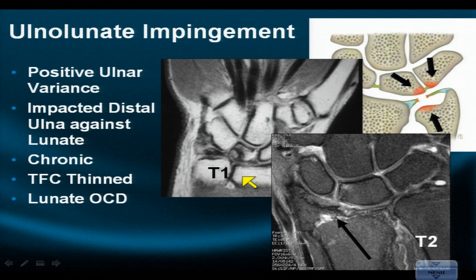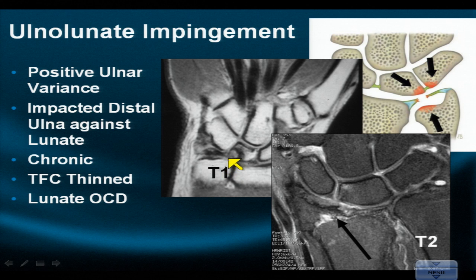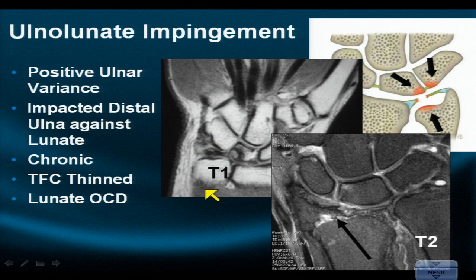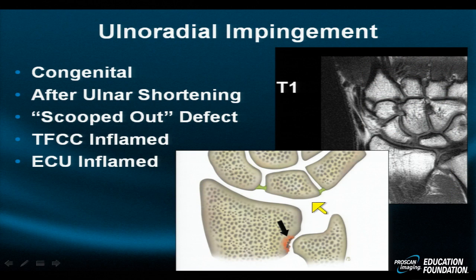A completely different patient is seen on a T1 simple fat-weighted image — so simple any scanner can do it — showing positive ulnar variance posture. The ulna is protruding only a few millimeters distal to the radius, yet dynamically this has produced destruction of the central third of the triangular fibrocartilage, destruction of the ulnar chondral surface, destruction of the lunate chondral surface with a pseudocyst in the lunate due to continuous abutment syndrome, and inflammation with synovial thickening along the ulnar aspect of the wrist. This is an advanced Palmer class IIC TFCC tear.